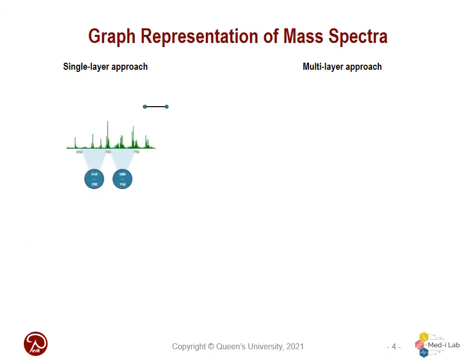In our first proposed method for graph conversion, we assumed a structure in which 50 M/Z subbands were considered as nodes and only connected to their immediate neighbors. This approach resulted in graphs with 16 nodes and 15 edges.